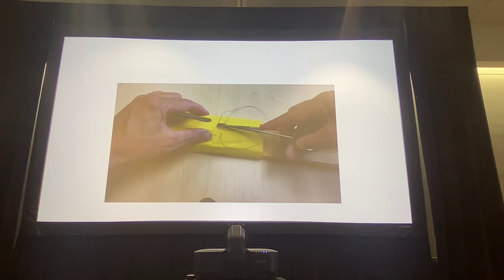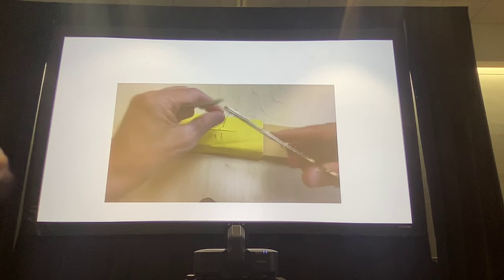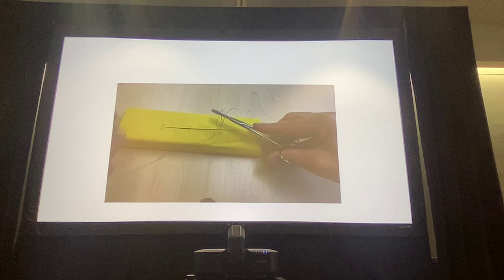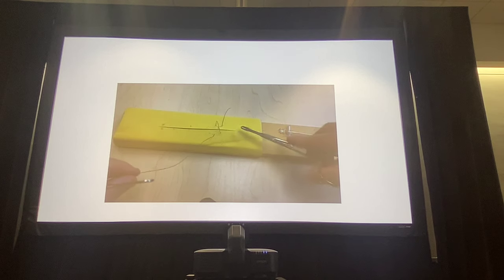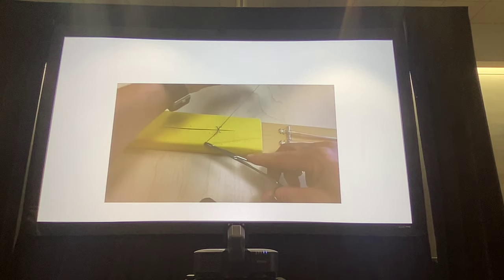And hopefully you can feel, it's hard with the prosthetics, but when you tie a knot down for a cruciate pattern, hopefully you can feel how strong it is in terms of knot security versus the ones we did previously. It's more obvious on real skin, of course, because you have that texture there, but it's good stuff.